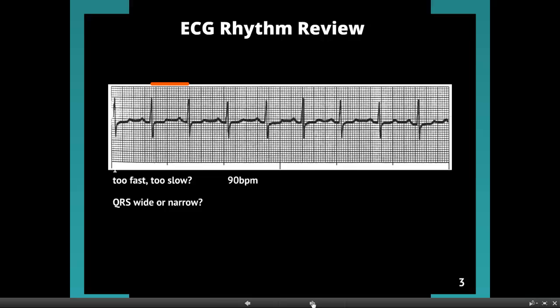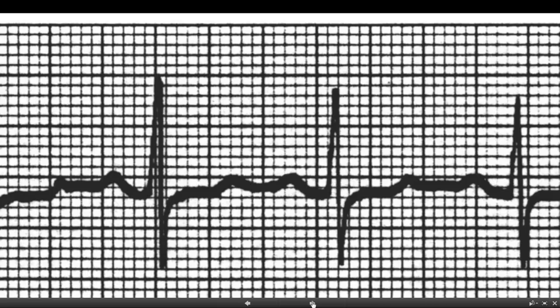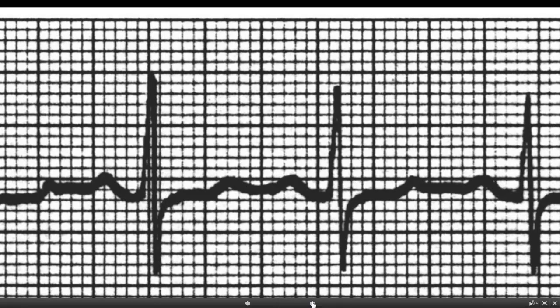Now we're going to ask the question: is the QRS wide or narrow? We'll zoom in here and take a look at one representative sample. Here we go to the QRSs — you see a P-wave right here. The QRS would follow that. That's the big spiky looking thing. And after that, it should be a T-wave, and I see a little bump over here — there's our T-wave. So now we have our components. We're looking for the width of the QRSs, and we want it to be under 0.12 seconds, which is three small boxes.